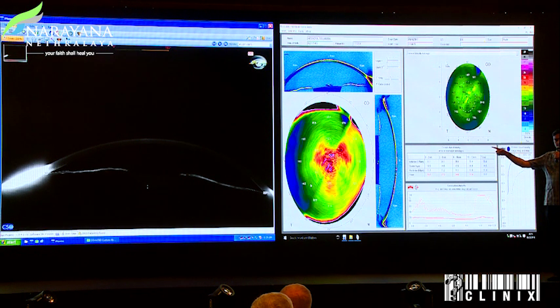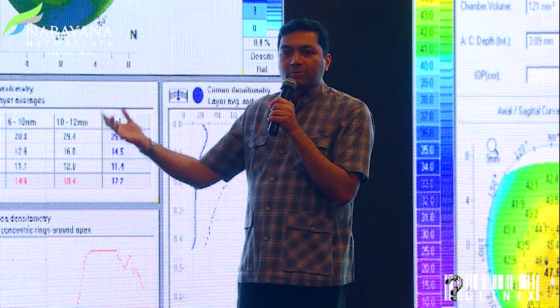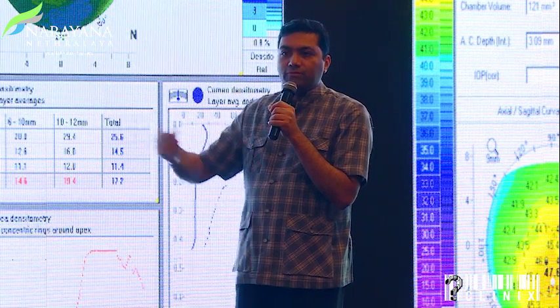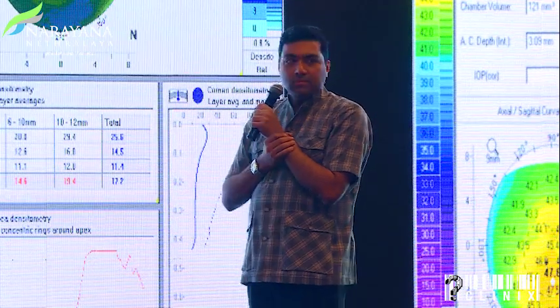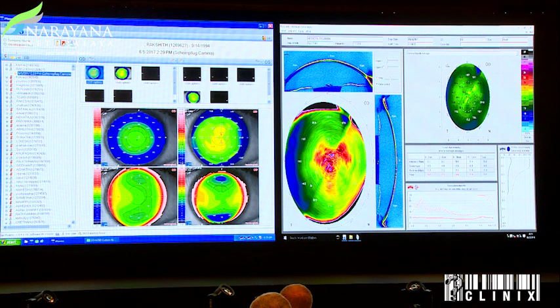Professor Saylor, do you have it? Do you know where? With the Pentacam, you can even make a profile. No, this is on the Cirrus, sir. Yeah, this is the Pentacam. Oh, yeah, here we have it. I'm trying to see if people who use Cirrus can also have some tool for them to use. We'll try to figure out. If we find it, we'll let you know by the time we leave.